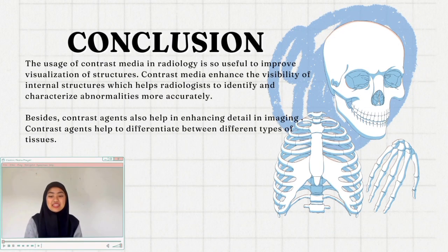And to conclude, the usage of contrast media in radiology is very useful to improve visualization of structures. Contrast media enhance the visibility of internal structures such as blood vessels, organs, and tissue, which helps radiologists identify and characterize abnormality more accurately.